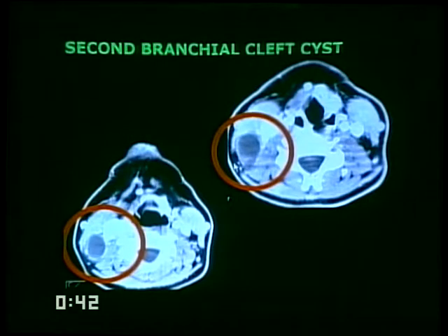This is a remnant. It's a congenital disorder. It is intimately related to the muscles around it because it grew up with the muscles themselves. You can't really describe it independently of the muscles. Often there may be enhancement of its surface, and that's just normal epithelial enhancement. There may even be a degree of reticulation of the fat around it, and that's just developmental.